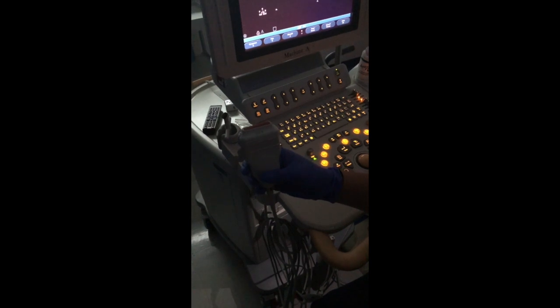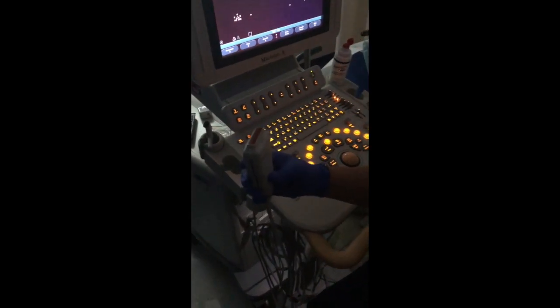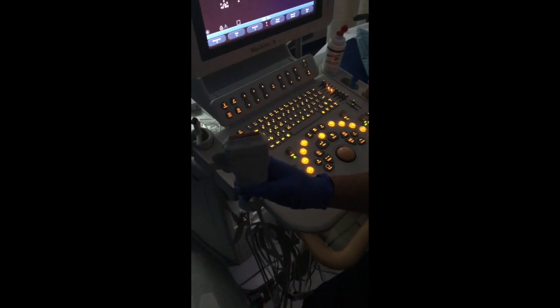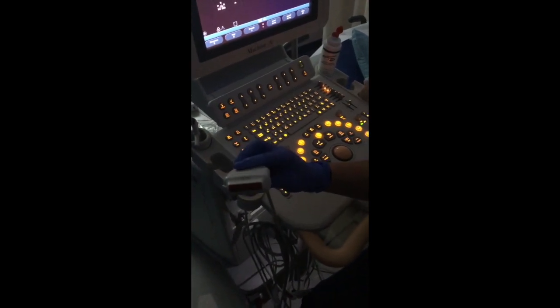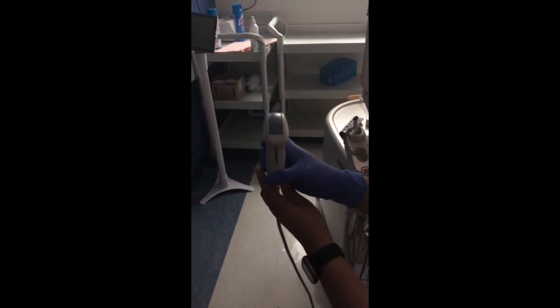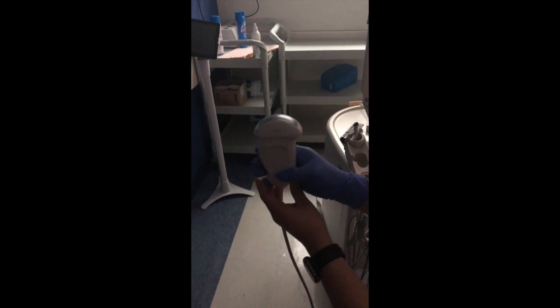This is the transducer we will be using for a scrotal study. It is a linear probe and is typically used on superficial structures such as the testes. When the testicle does not fit in the field of view, we use the curved linear probe to obtain the measurements.